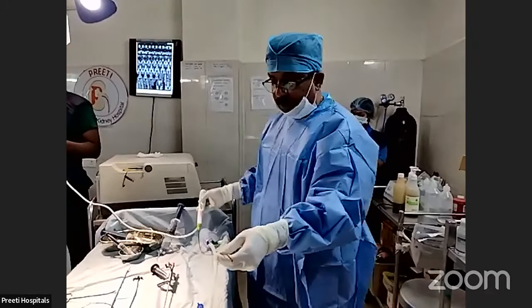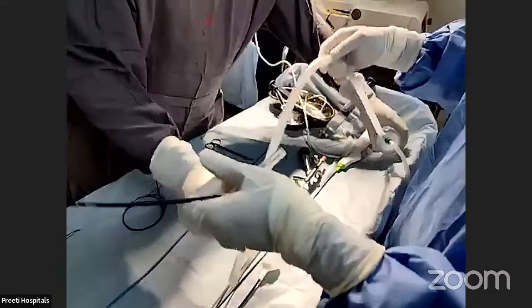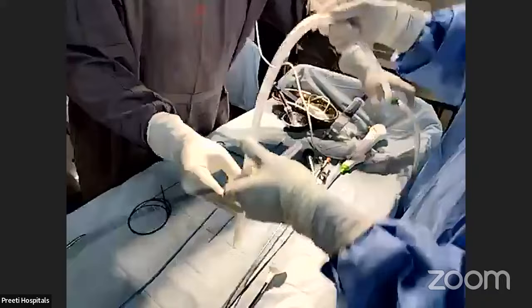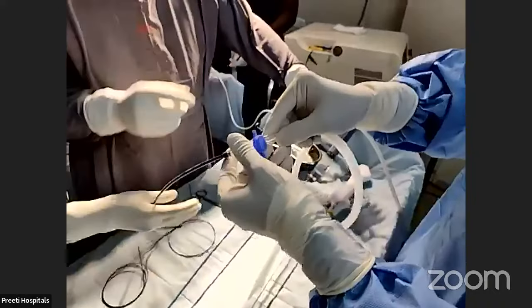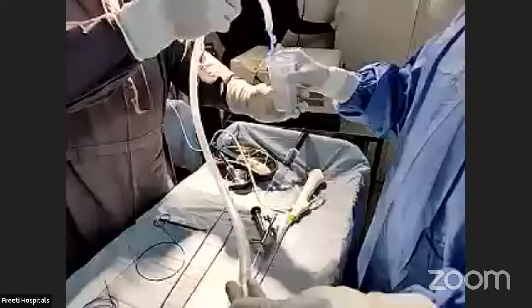That means what type of suction is here is, the suction tubing is there. This is the suction tubing. We put this suction here. Where is this suction? There is a hole here. Here. Here. Can you focus that hole? Here. Here. Are you seeing? If I press this, it will suck. If I don't press, normal water will come out.